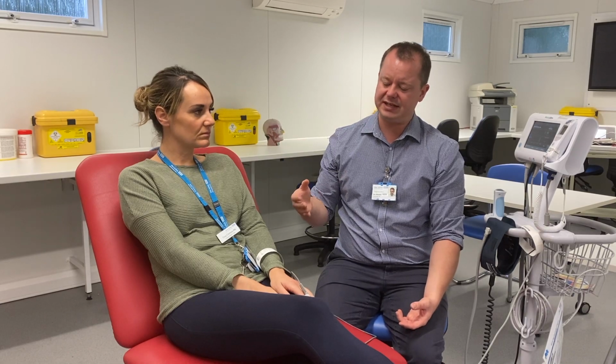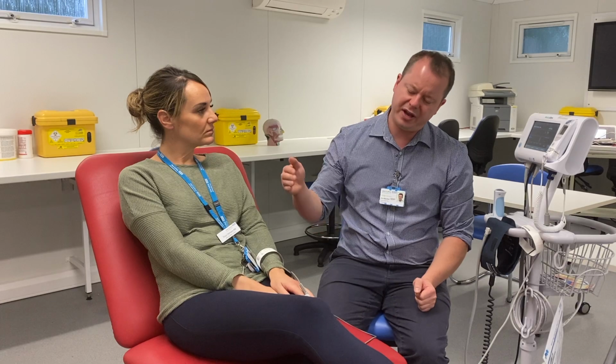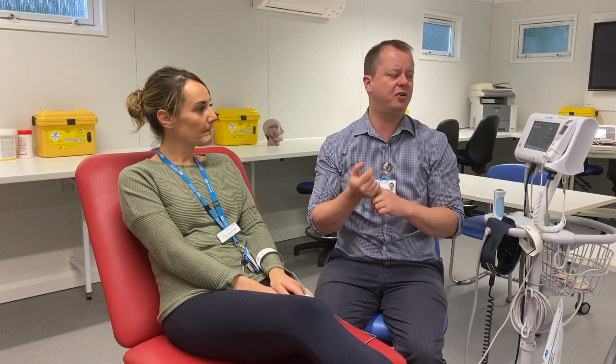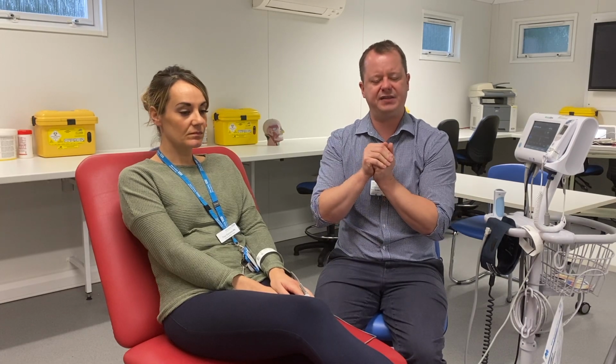It's important to also understand that if your patient has a bit of a low blood pressure, or if they're cold, they might not have a good blood supply to their hands, so it might not record the saturations of oxygen accurately.